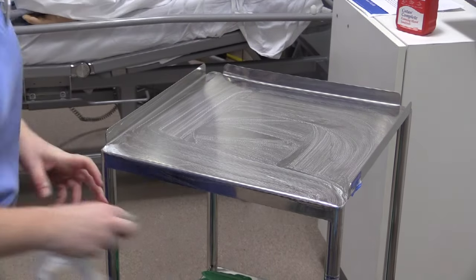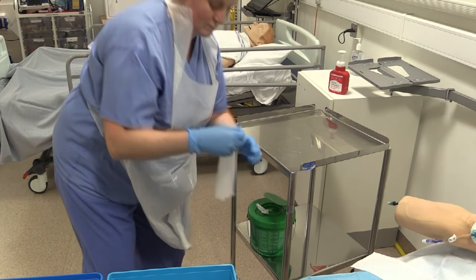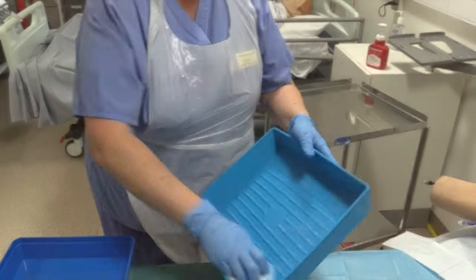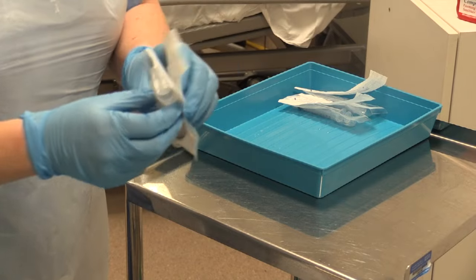Clean the trolley with a Clinell wipe and then apply apron and gloves. Clean one blue tray with a Clinell wipe or suitable alternatives in the community setting. Equipment should be prepared using the aseptic non-touch technique.